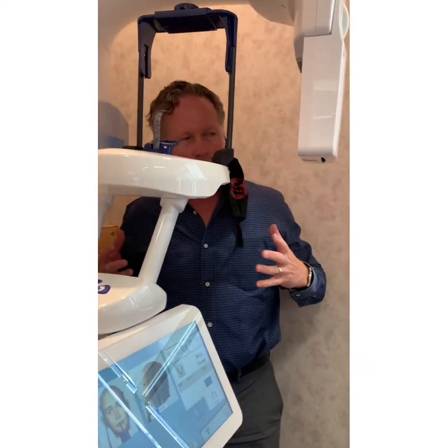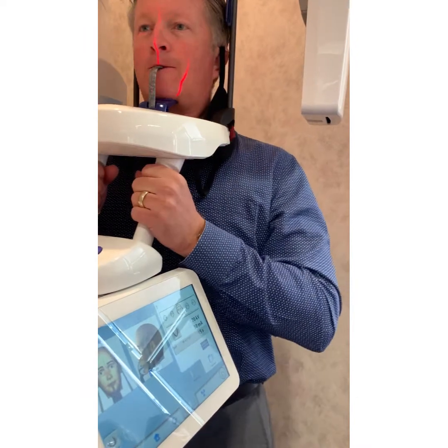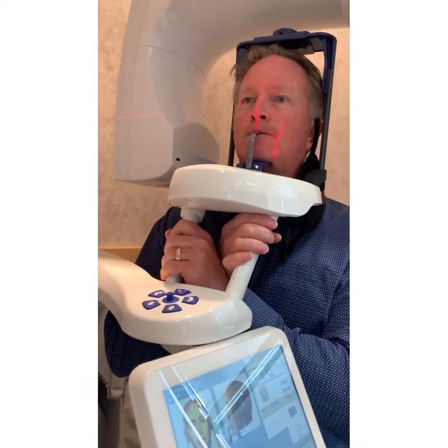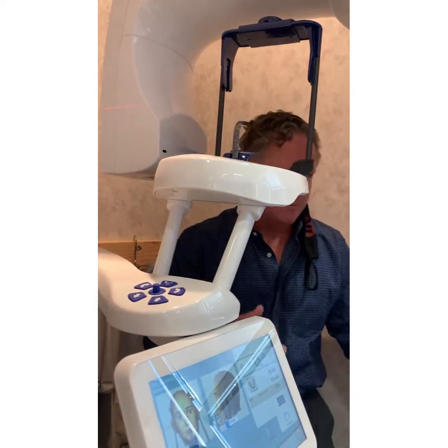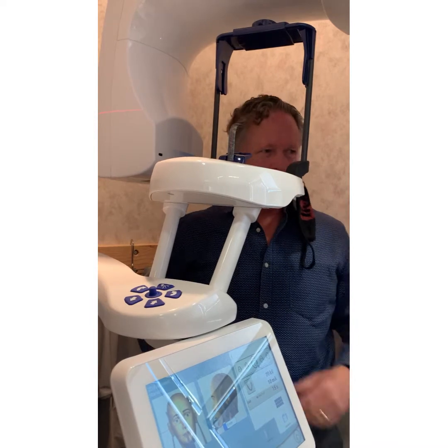But you're going to have people that are broad. You just want to make sure this clears the shoulder and C-spine as they're here. If you think it's not going to clear, crossing the arms drops the shoulders down. But if you put somebody with a smaller frame in there and they cross, it'll make them hunch. So save that for the bigger, broader folk.